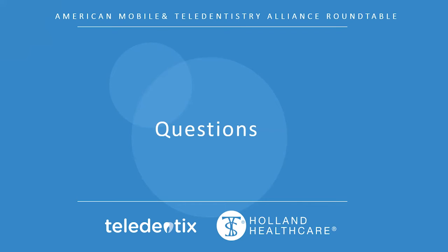Awesome. And then on that, Bill, we did get questions about pricing for the Teledentix subscription and TelScope. So if you could speak a little about that, and comparing to traditional practice management software, the pros and cons of each would be great.